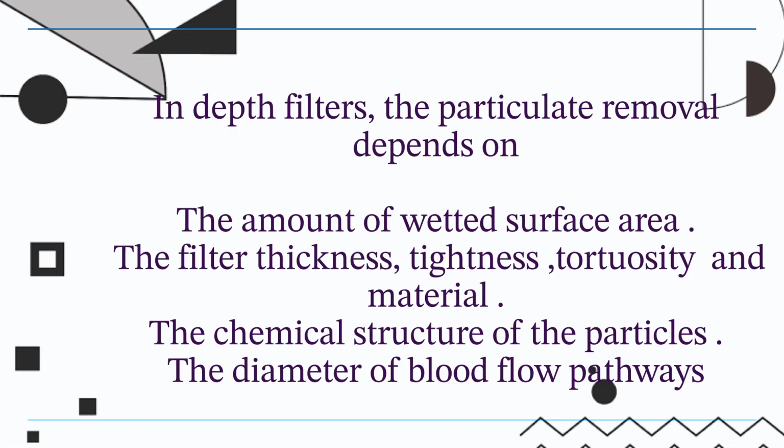In depth filters, the particulate removal depends on the amount of wetted surface area, the filter thickness, tightness, and material, the chemical structure of the particles, and the diameter of blood flow pathways.